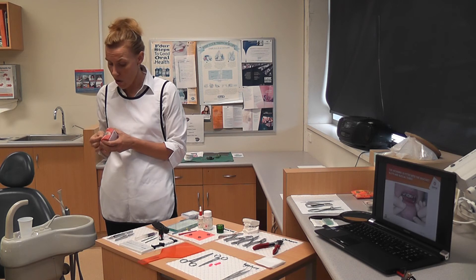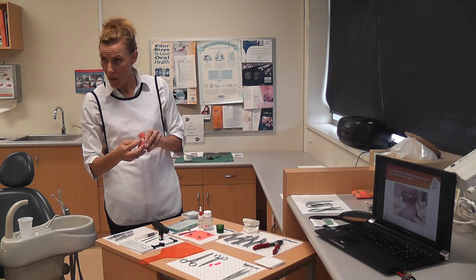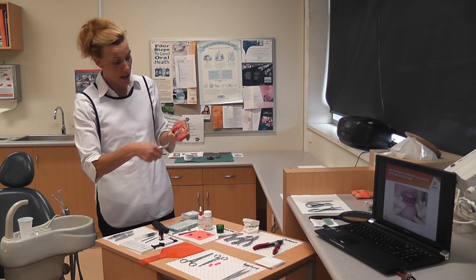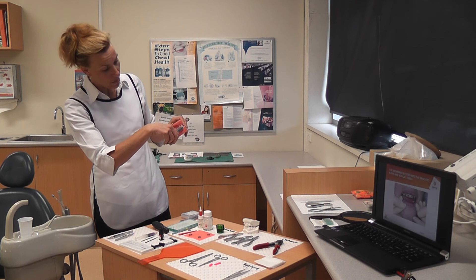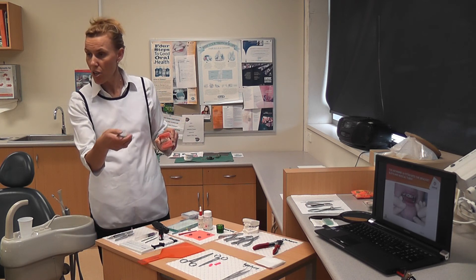It's really going to dig in there, so we need to cut that excess off. We are working down the back of the mouth and around the back of the corner, which is a little tricky. We've got a specialised instrument called a distal end cutter. It's designed to go round the back and down the side, and they just snip it off so that excess arch wire comes off.